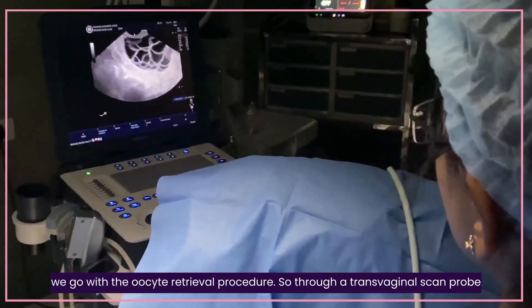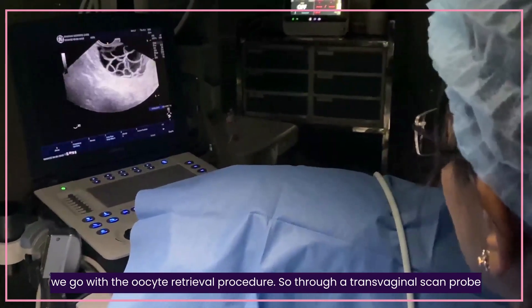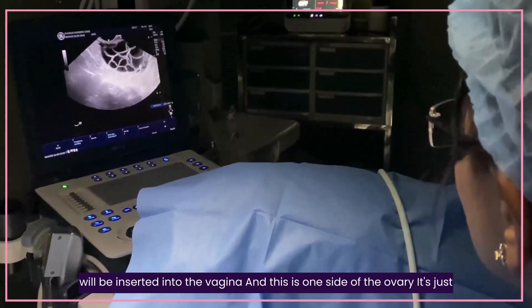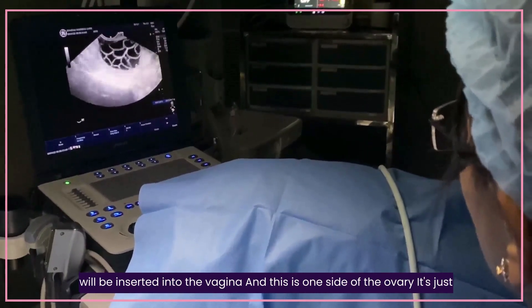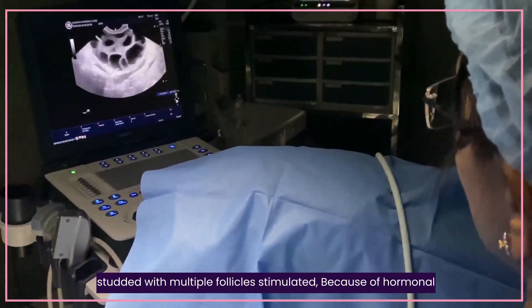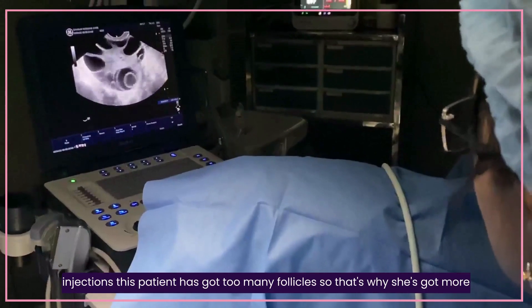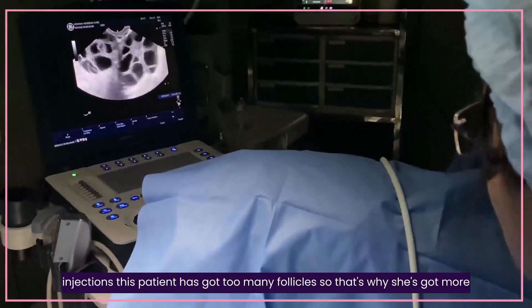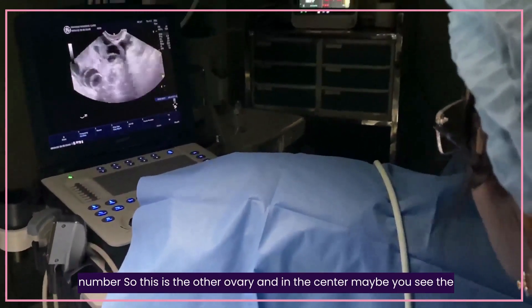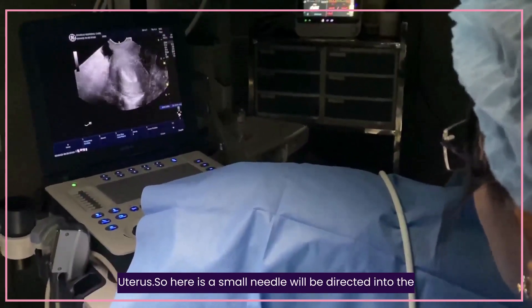We go with the oocyte retrieval procedure. Through a transvaginal scan, a probe will be inserted into the vagina. This is one side of the ovary, which is studded with multiple follicles stimulated because of the hormonal injections. This patient has got too many follicles, so that's why she has a greater number. This is the other ovary, and in the centre we will see the uterus.